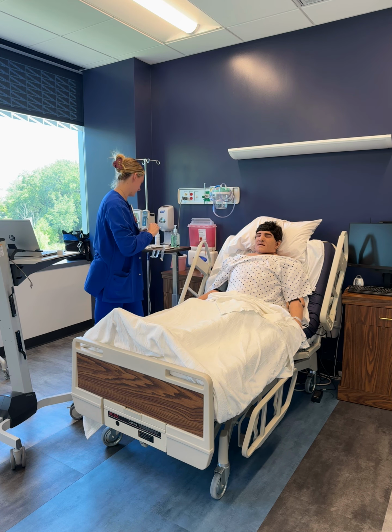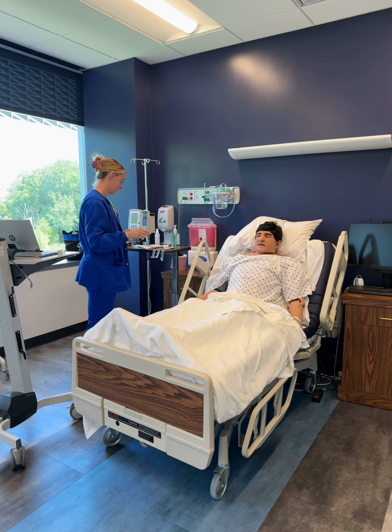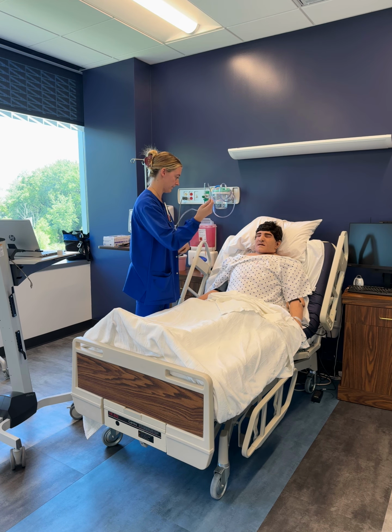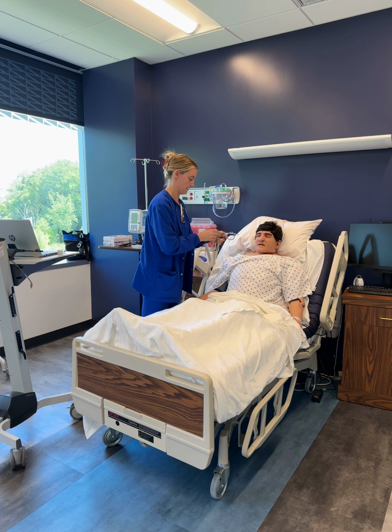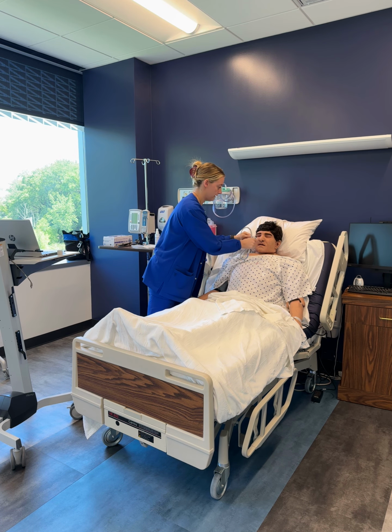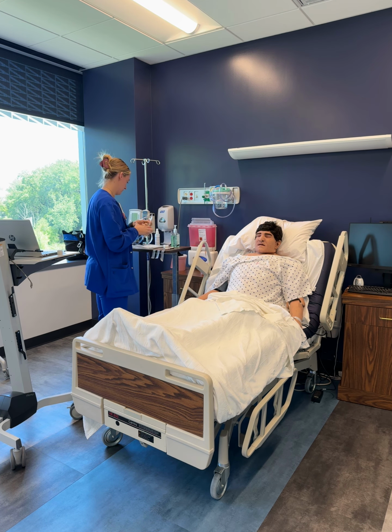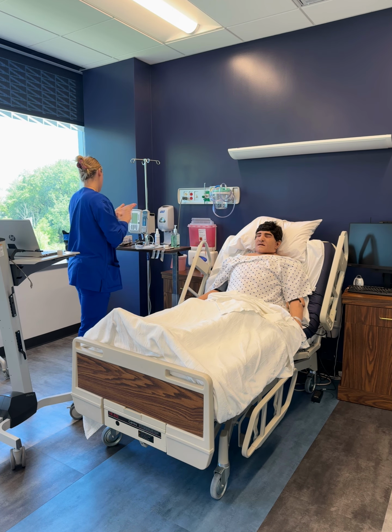Gag reflex is intact. I am then going to get the materials to measure how far we need to insert, going from the nose down to the ear to the xiphoid process, which is 55, and then adding 10, so we're going to go to 65. At this time, I'm going to perform hand hygiene and apply gloves.